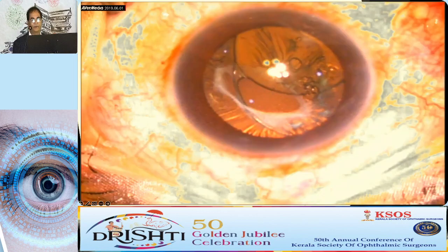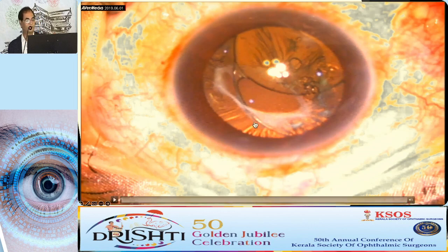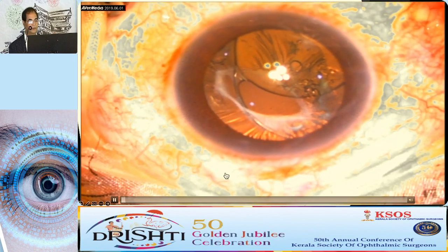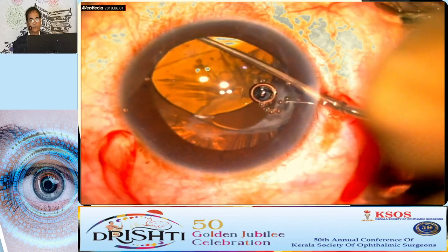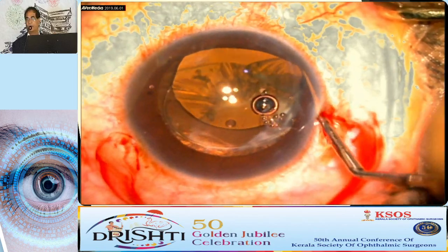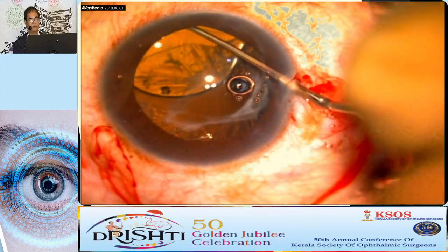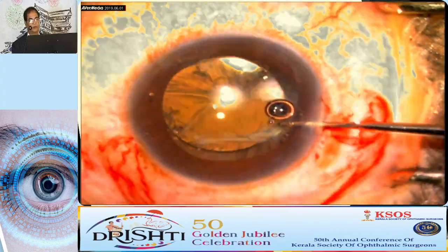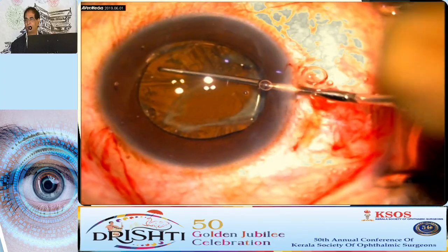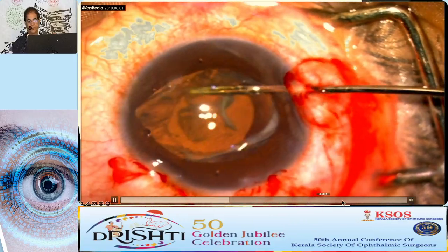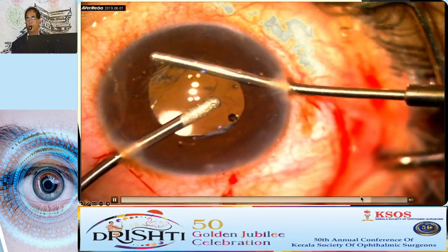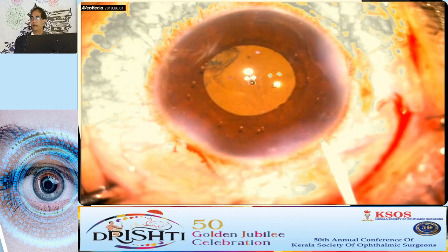This is another previously operated case. If you do not manage the vitreous, it can push the lens away and the haptic becomes incarcerated. The first thing is to remove the lens and bring it into the anterior chamber. The haptic usually will not become fibrosed, so you can dial the lens. If it is not dialing, use your side port or cut the fibrotic band. You cannot leave the lens in the sulcus like this even after vitrectomy.